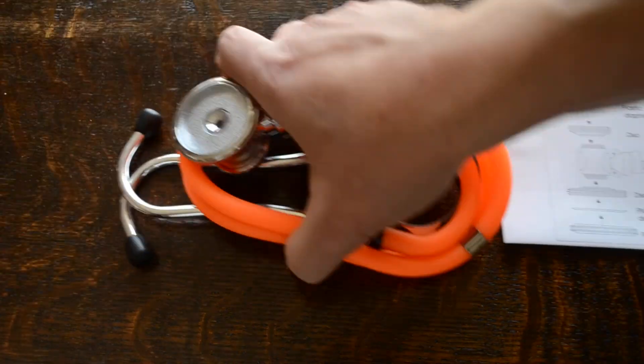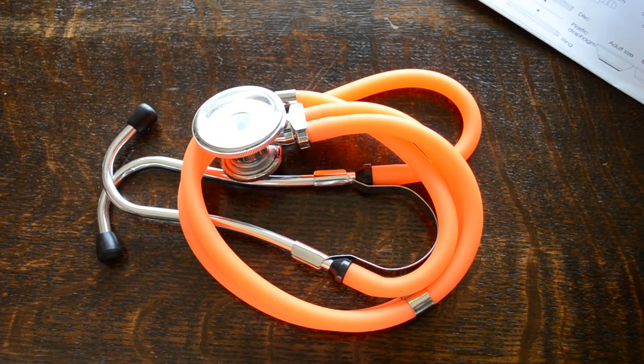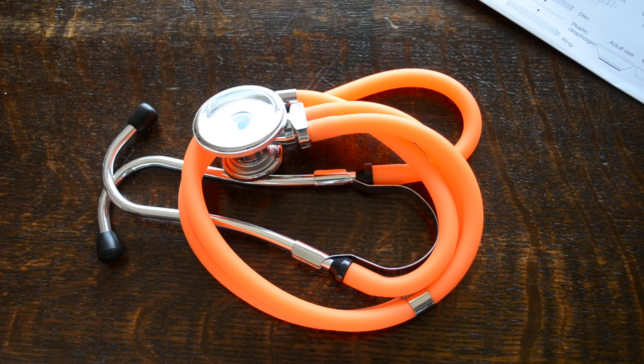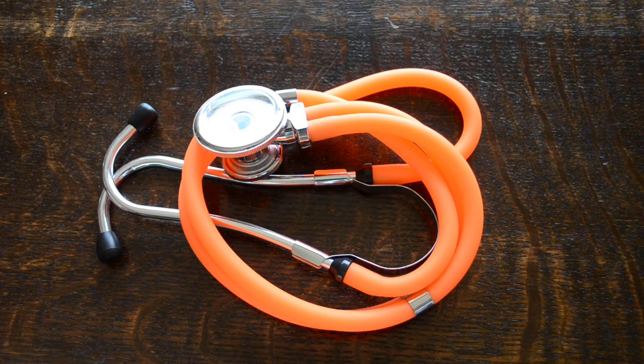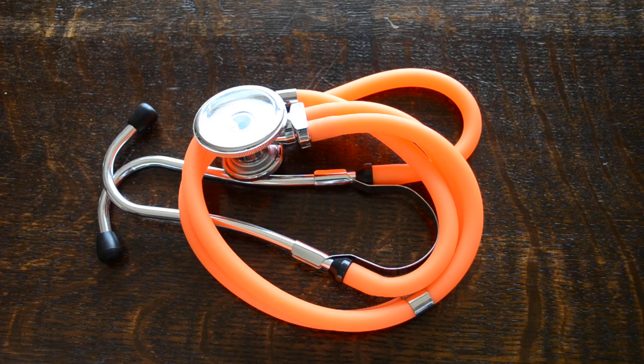So just bring the stethoscope back into show again, just to show you the brightness of those orange tubes. Really nice, bright stethoscope. This is going to give you very good auscultation quality when you actually come to use it. Obviously going to stand out from the crowd.